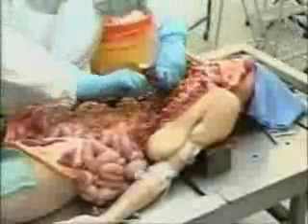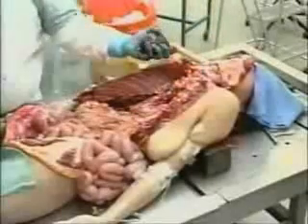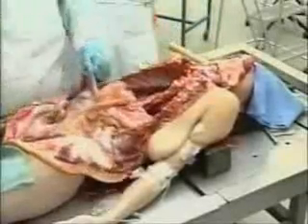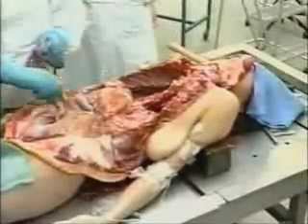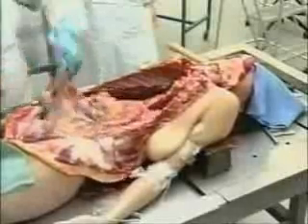Pardon me, the spleen is coming out now. That sits in the left upper quadrant of the abdomen. That's about normal shape and size. What he's doing now is putting a clamp on the proximal end of the small intestine, the duodenum, and then he'll free up all of the intestine so that it can be removed in a block.